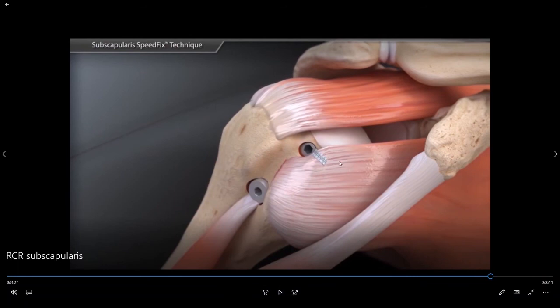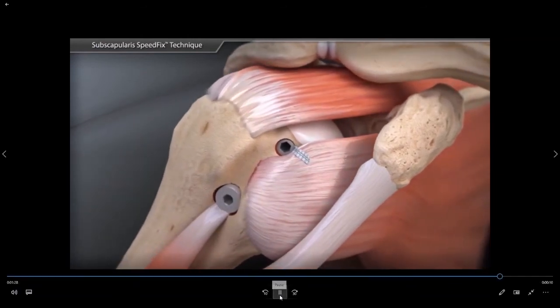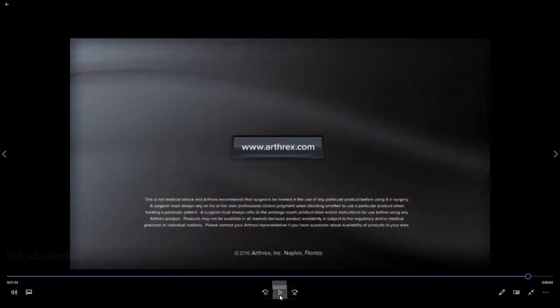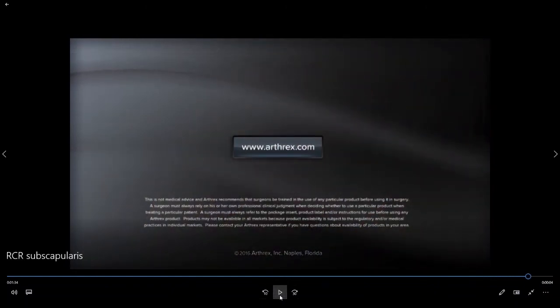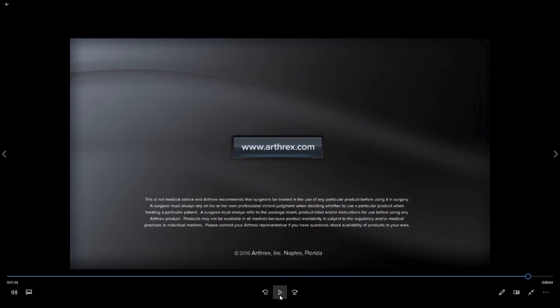So now we have brought the subscapularis tendon back out to length. We have stitched the tendon back down to the bone with a little screw and have completed the repair of the subscapularis. I would like to thank Arthrex for providing the implants necessary to perform an arthroscopic subscapularis repair, and also for providing the surgical animation for this video. I hope this video has helped you to better understand the difference between a subscapularis repair and a traditional rotator cuff repair. Have a good day.